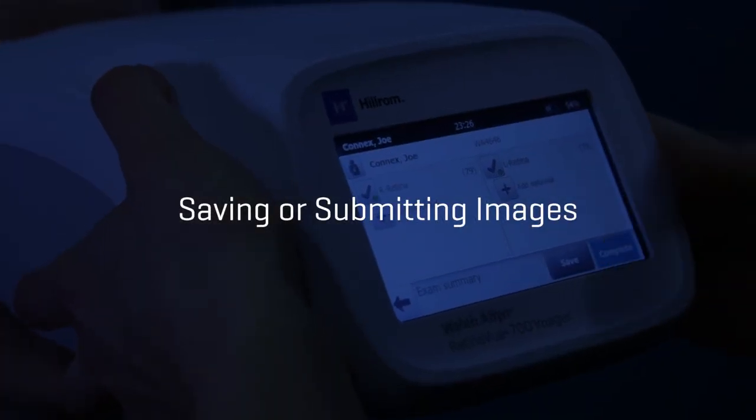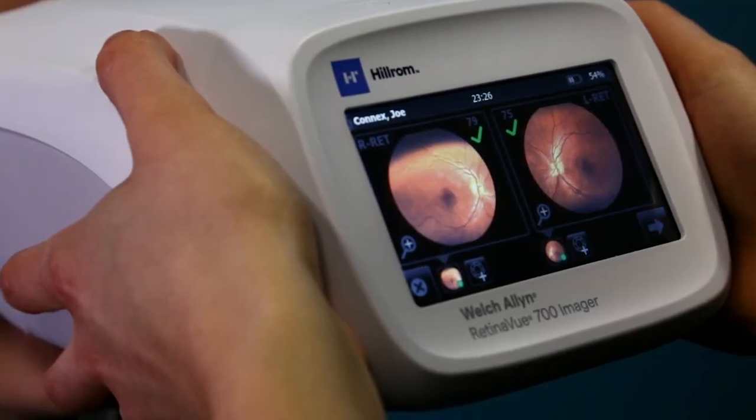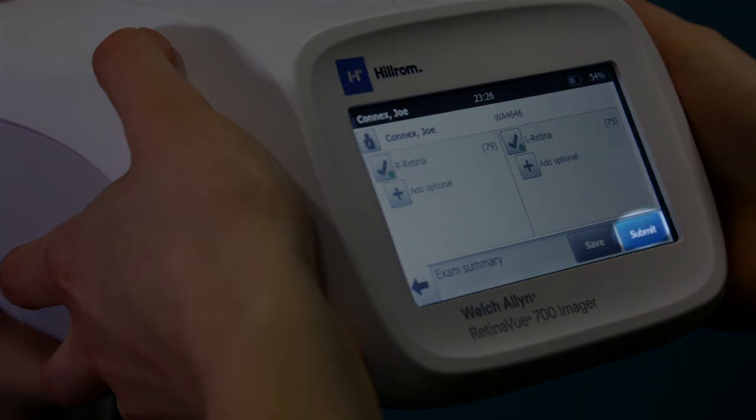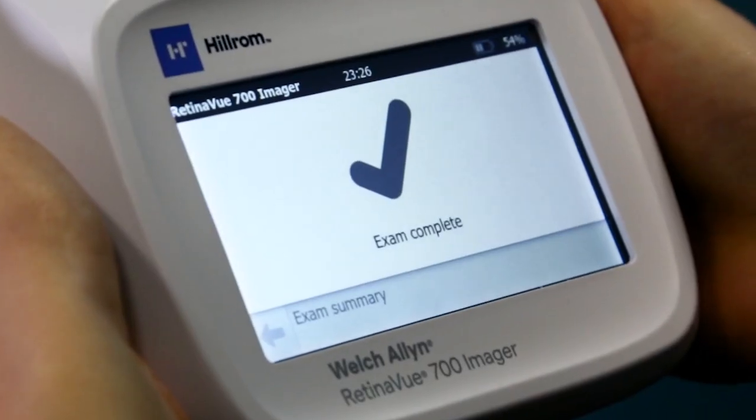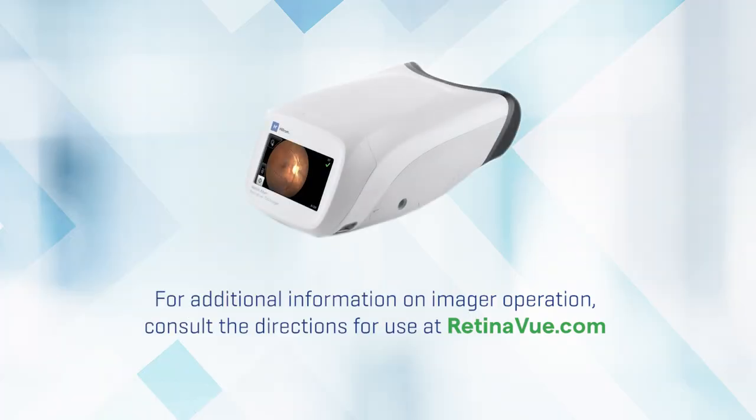Saving or submitting images. To save or submit the images, proceed to the exam summary screen and select Submit. For additional information on imager operation, consult the directions for use at RetinaVue.com.